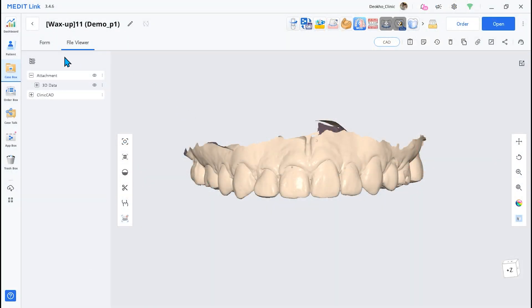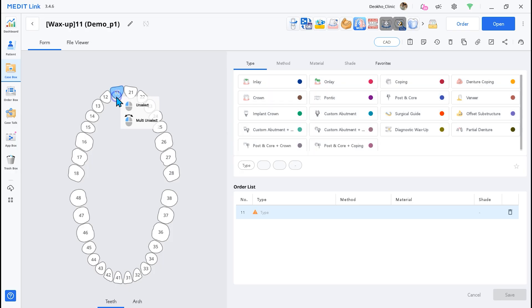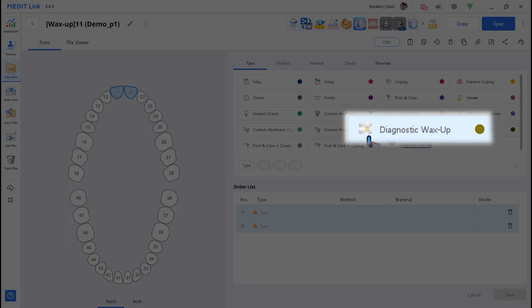First, the Diagnostic Wax-Up mode is added. Select the teeth in the form and go to type, then choose Diagnostic Wax-Up.